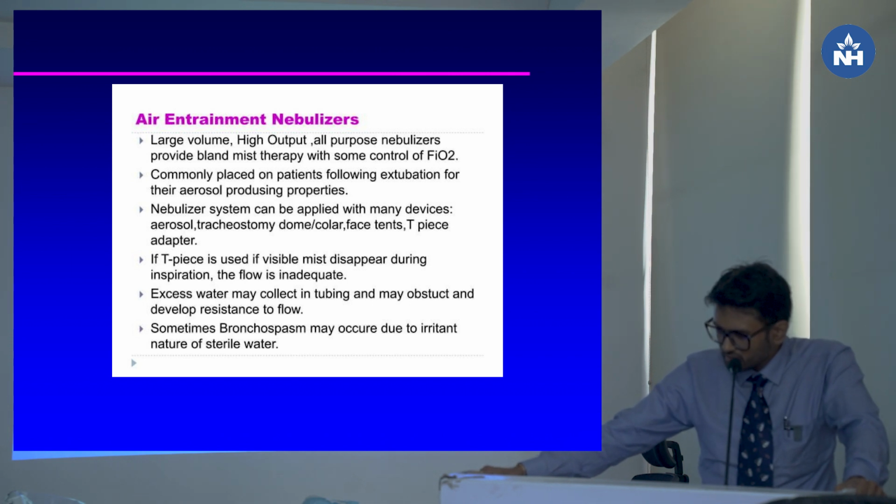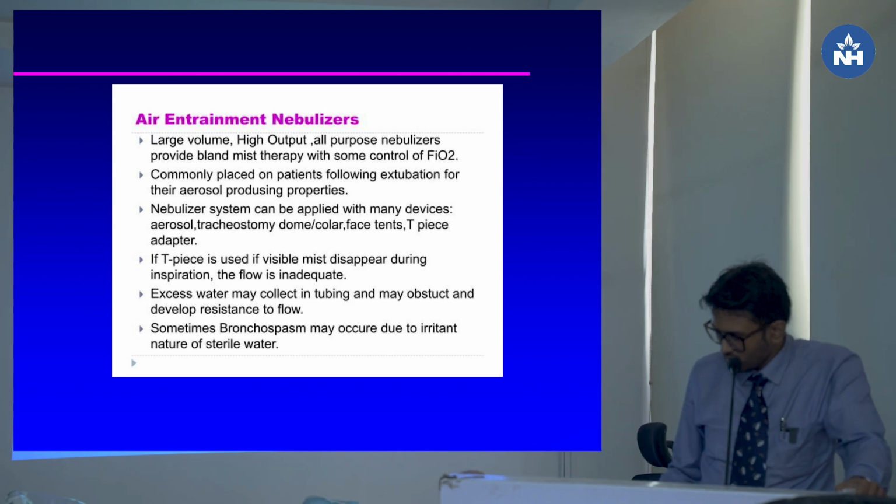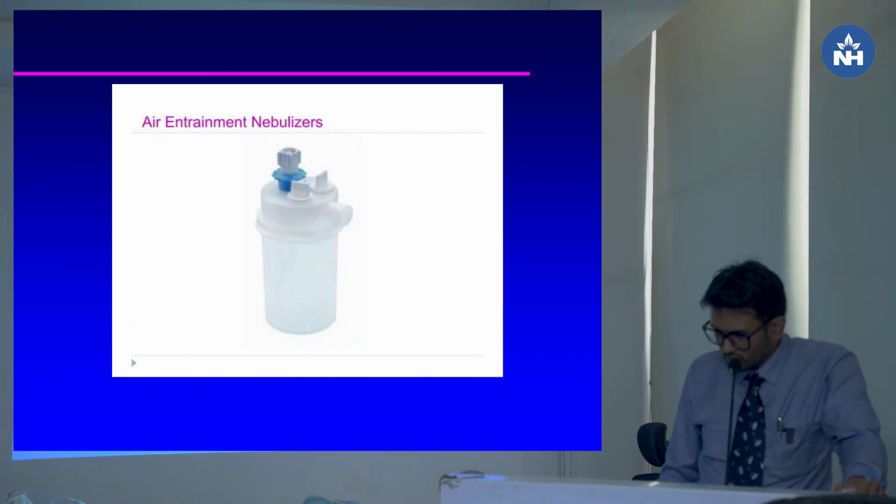Excess water may collect in the tubing and may obstruct and develop resistance to flow. Sometimes bronchospasm may occur due to the irritant nature of sterile water. So this is the air entrainment nebulizer.